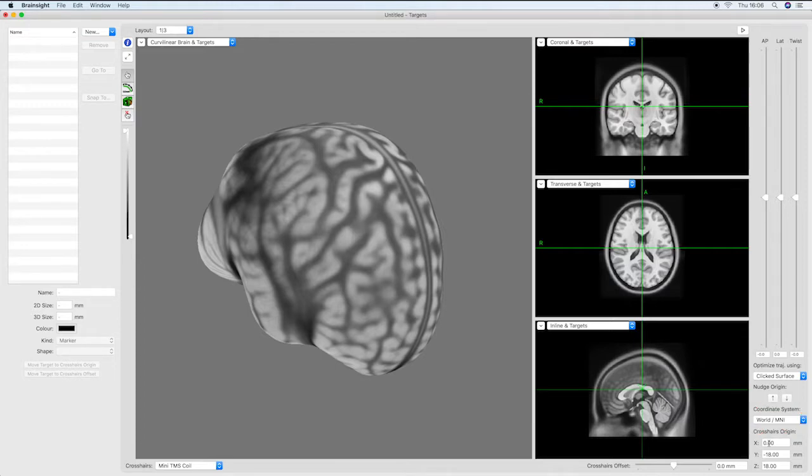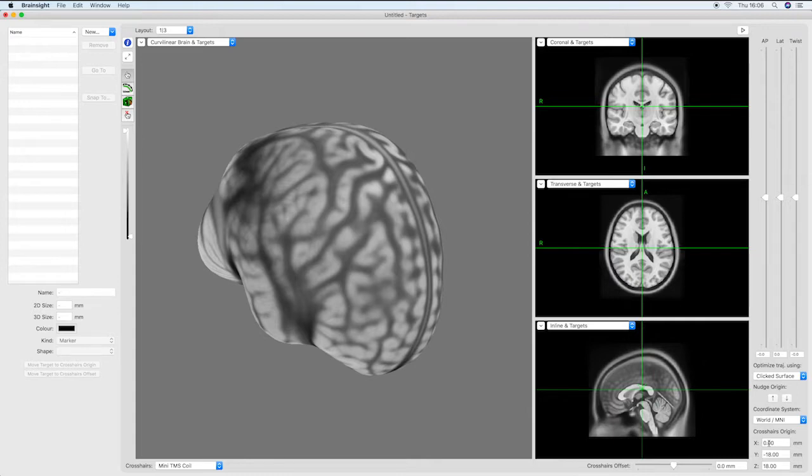For real MRI projects it would be necessary to first complete an atlas space registration in one of the previous steps of the project in order for the MNI coordinate system to be available in this list.